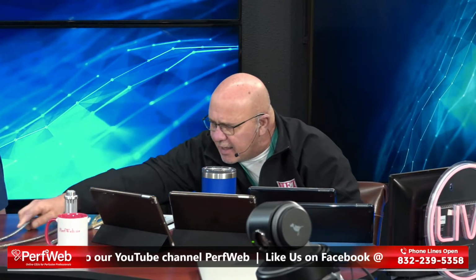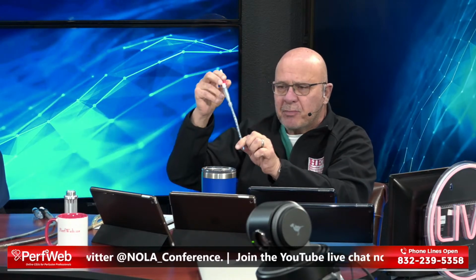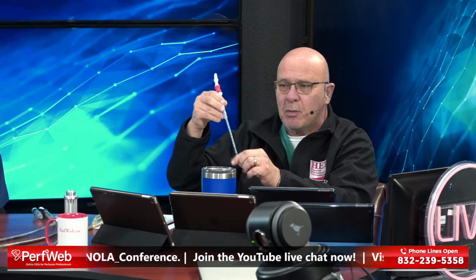When you use that cannula, you're usually going to have the dual cannulation technique. In fact, one of our scenarios incorporates that. This is traditionally a femoral arterial return cannula. It can also be put in the subclavian, of course, with a graft, but most people don't. They just use a connector. But nevertheless, historically for ECMO with the dual cannulation strategy this would go into the right IJ.